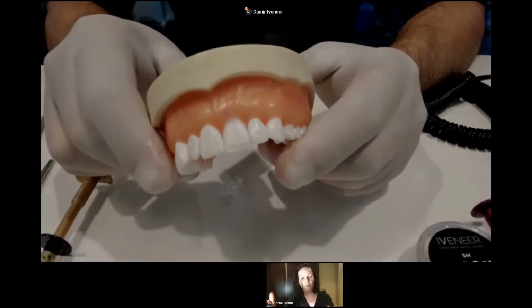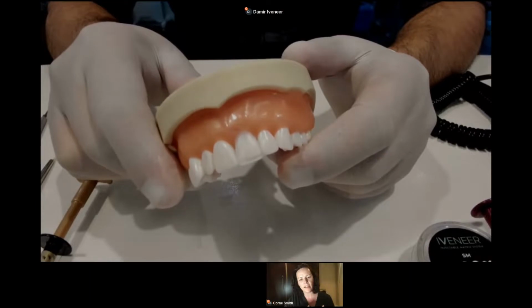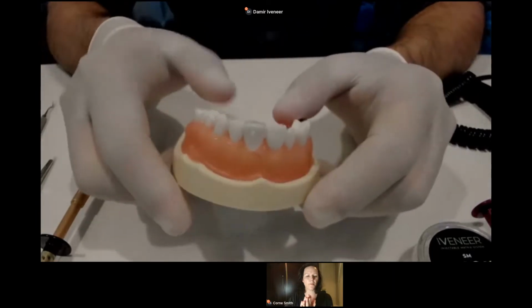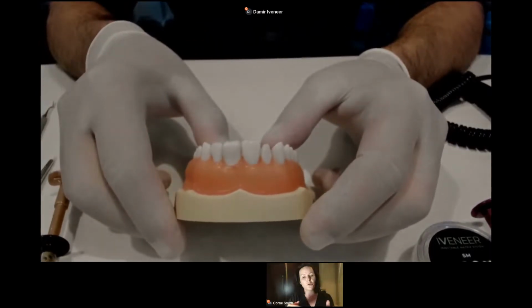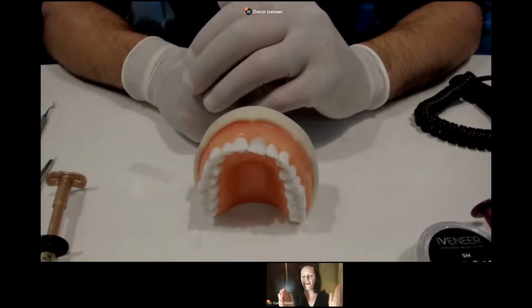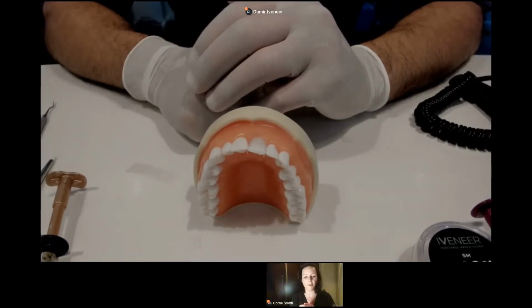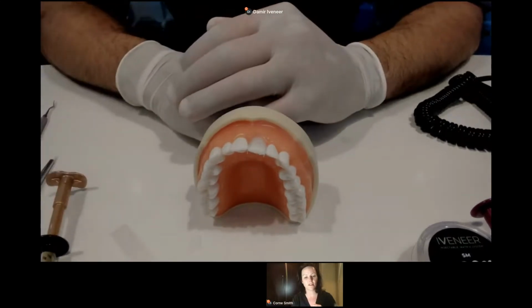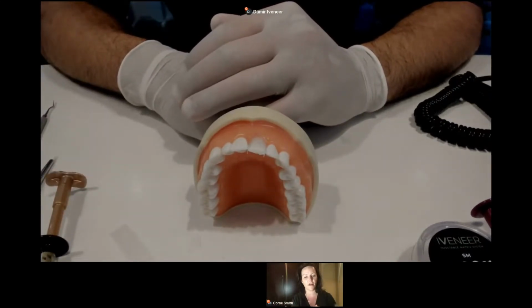I remember, Itai, when I was standing with you in your clinic and you were doing cases, there were a couple of cases where the moment you fit the matrix, it looks like it's going to be too long. But however, the width of the matrix is actually perfect for the teeth. And I remember the way that you still filled up the whole matrix with flowable composite and then you reduced it. So I think it's important for people to understand, because I've already had questions from dentists in South Africa about my matrix being too long. I think it's important to understand that that's not a problem.